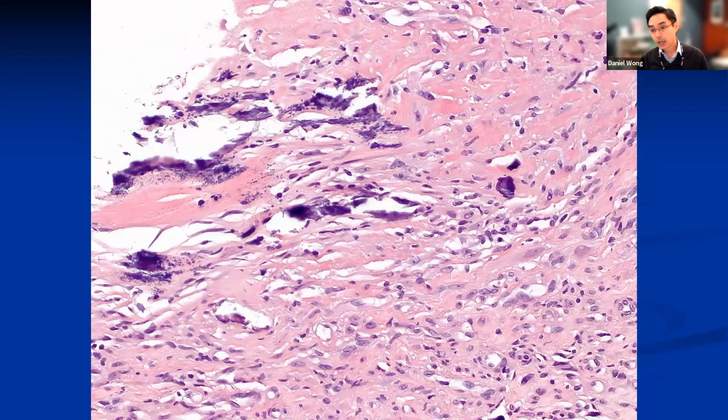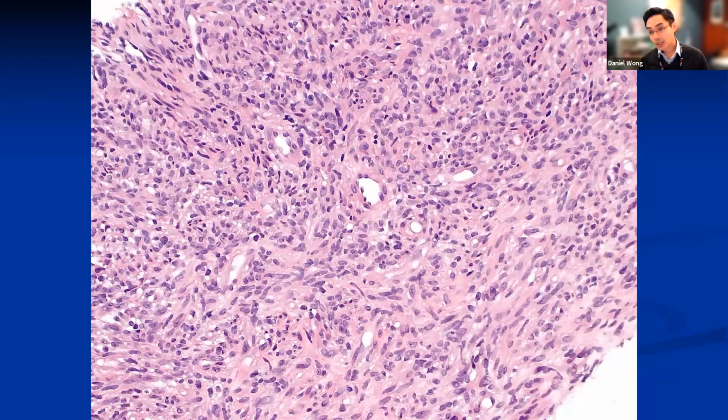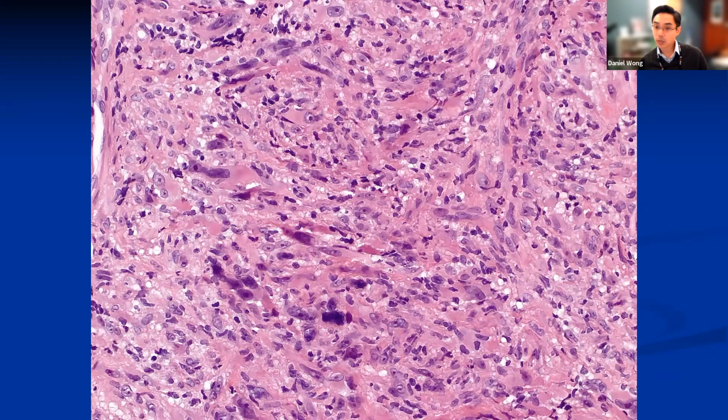There was spotty calcification, just like we saw on the CT scan. And for the most part, the cells were very bland in appearance, very uniform nuclei, but there were also some focal areas of increased cellular pleomorphism, where the cells showed nuclear enlargement and hyperchromasia. You can also see the deep eosinophilic cytoplasm, but there were no cross striations like you would see in rhabdomyoblastic cells. Mitoses were not readily identified in this, and there was no necrosis.